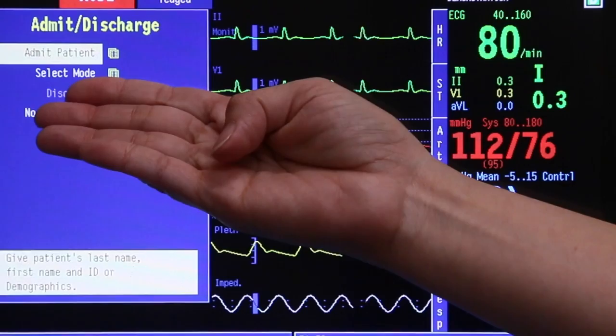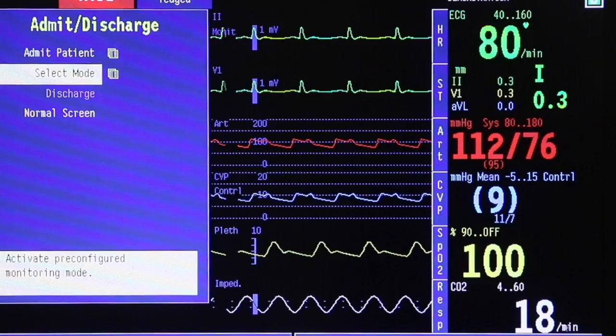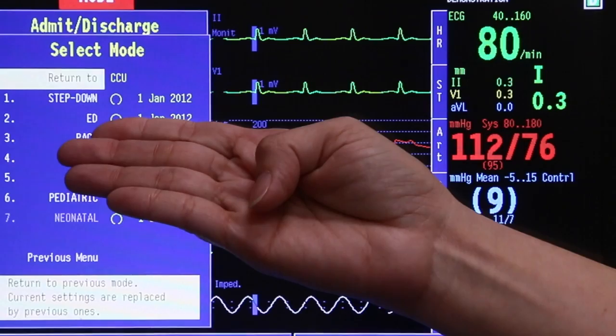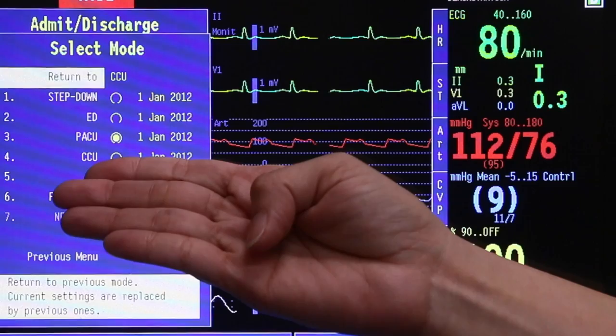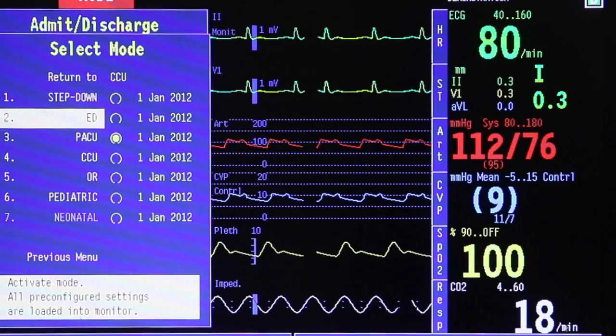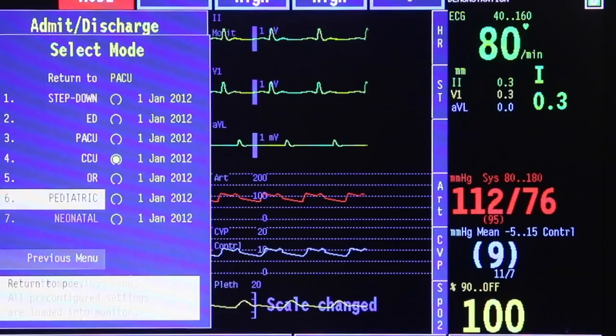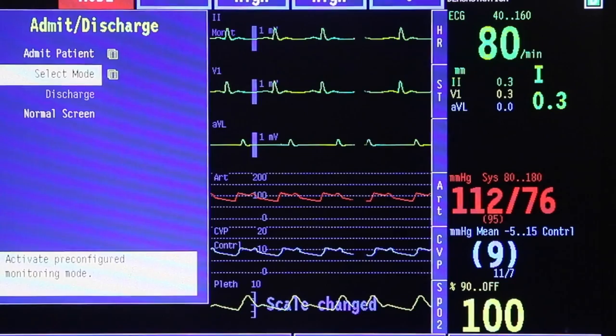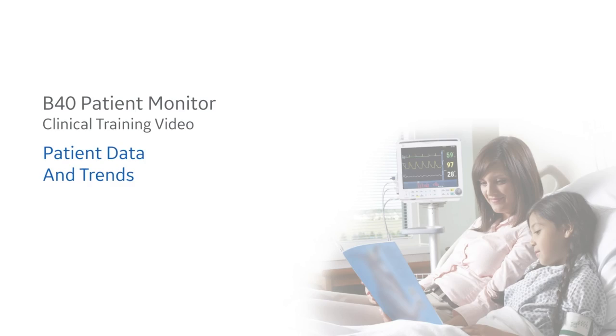Click previous menu once again. The next option will be to select the mode. Press once and it will ask you which type your patient should be at — whether in a step-down unit, emergency department, post-anesthesia care unit, coronary care unit, operating room, or whether your patient is a pediatric patient or a neonate. Select your option by scrolling the trim knob and press once to confirm. Then go back to previous menu, scroll down to normal screen, press once, and you are back in your home screen.